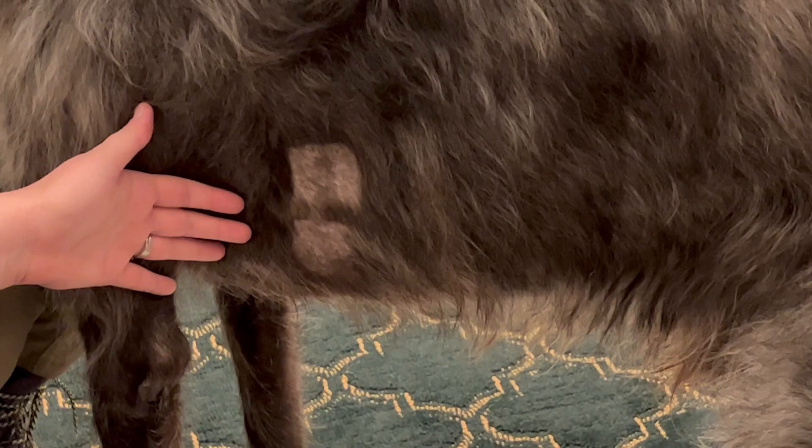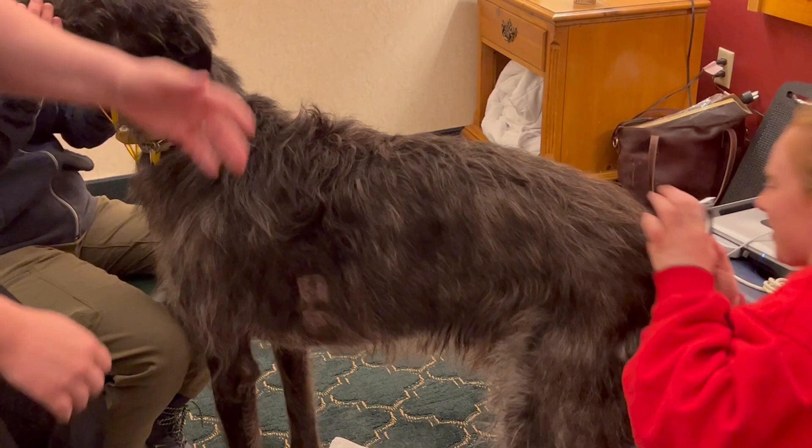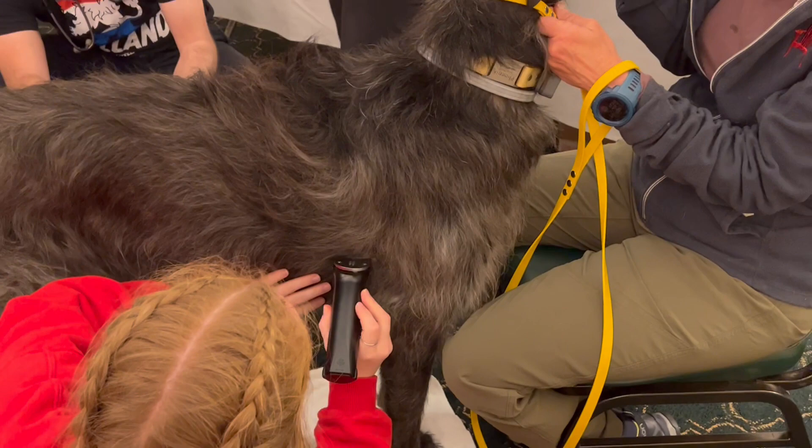Let me get a close-up of that. Do you want to do the other side? Are you comfortable with the other side? Same thing on the other side — you're just going to feel where you can feel his heart, and then do a similar patch. You just want to make sure it's not too close to his elbow. That's perfect.